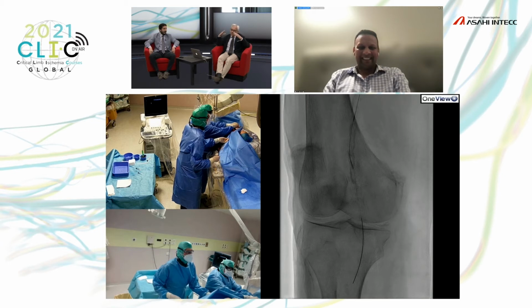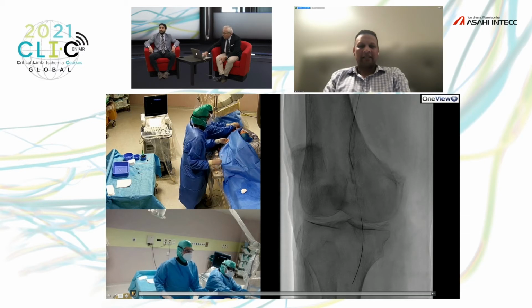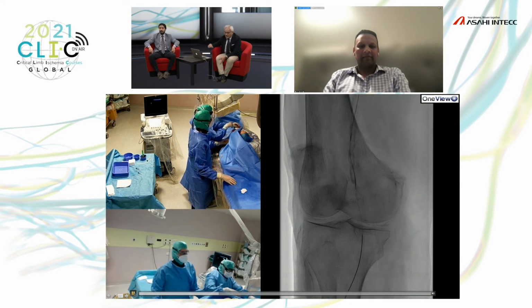Sometimes we have to try to reset our connection, hands, brain, when we have new devices. And for me, this was a good test. With the same wire, it's not always possible to do everything.